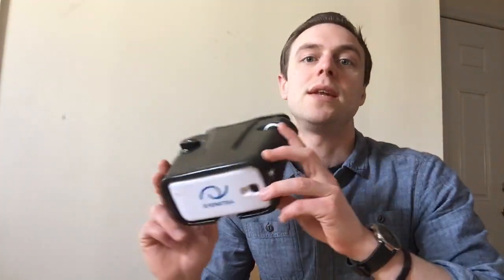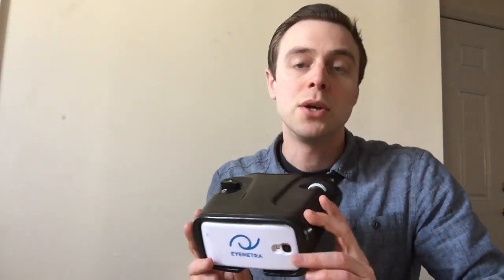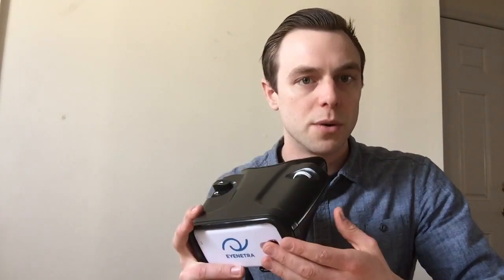This is the iNetra autorefractor. It retails on our website, store.inetra.com, for $1,099 US dollars, and that comes with the phone included with all the accessories and preloaded software.